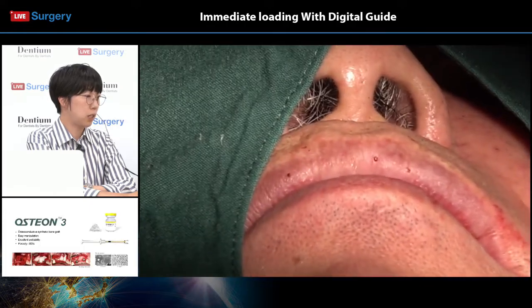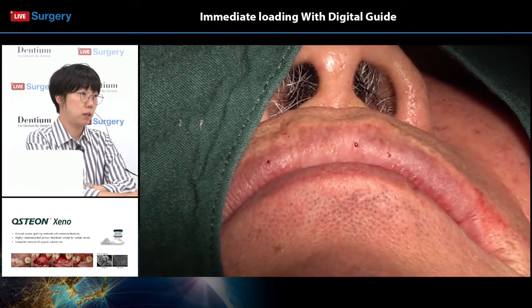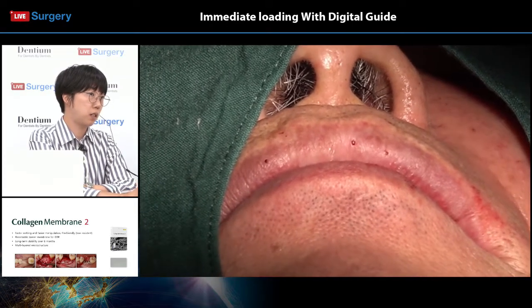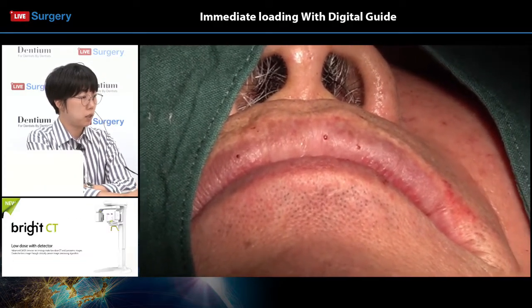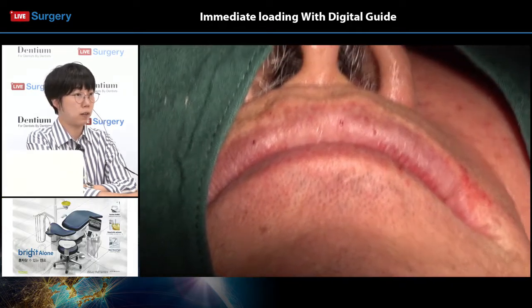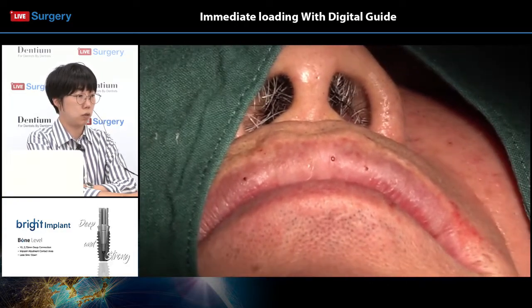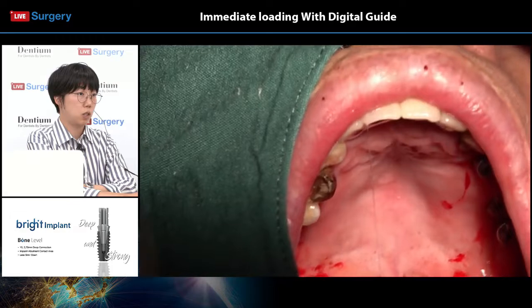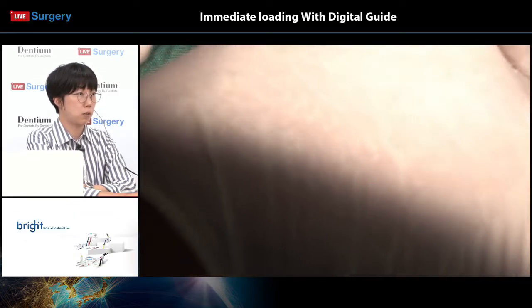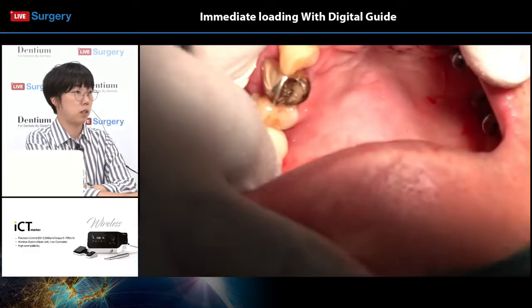Usually the pre-made bridges have an internal gap up to 1 millimeter in multiple cases. But in cases like this where we are only splinting 2 to 4 crowns, usually a minimal gap of 0.5 millimeters is put into the crown, so no additional relining is necessary chair side. Okay, so Dr. Lee is now checking the temporary crowns. If the occlusion is okay, I believe he will wrap up today's surgery.